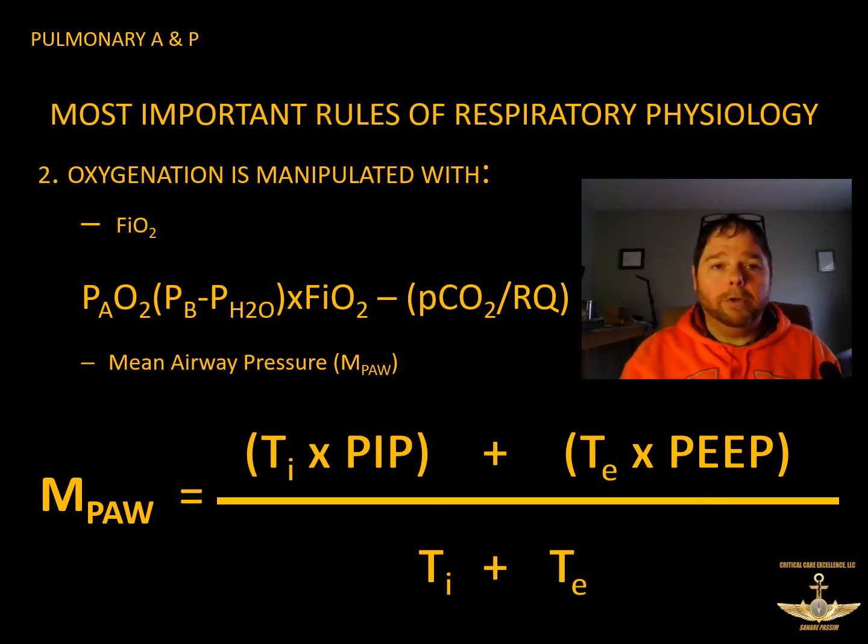As we move forward, you'll see how we make those numbers work. So as we have a patient who is having difficulty oxygenating, we're typically going to go with that more PEEP. When I show you the reference that I put out this week, you'll see the strategies we talk about to increase oxygenation by manipulating FiO2 and PEEP at the same time.